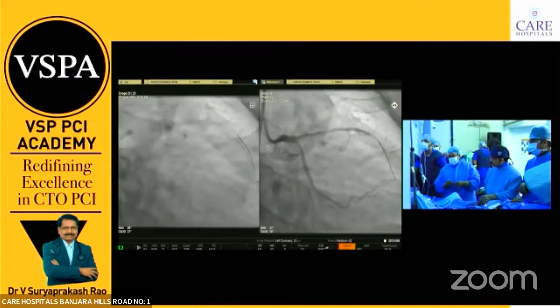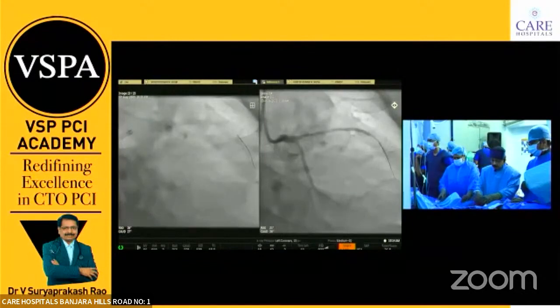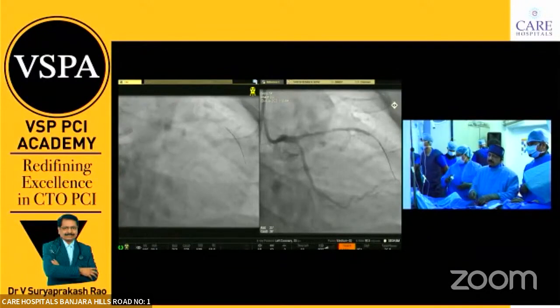We'll do it at 3, no problem. Yes, we'll expand that. This is the usage of imaging, where the follow-up looks good after good apposition and there's no malapposition, that is why we have to spend time in these cases.